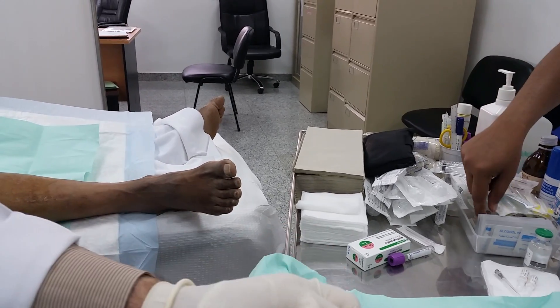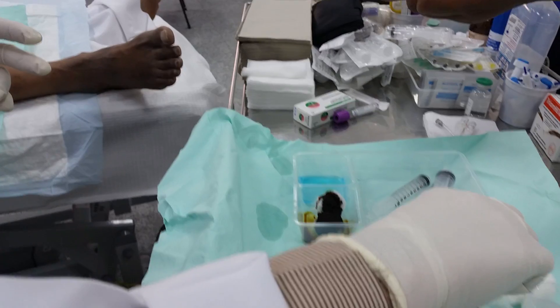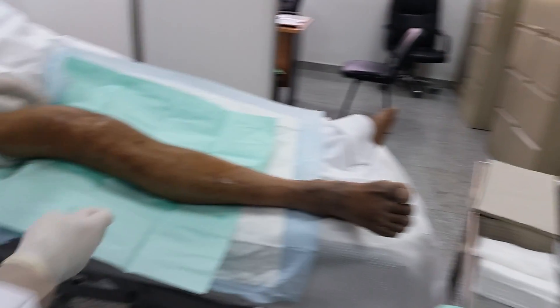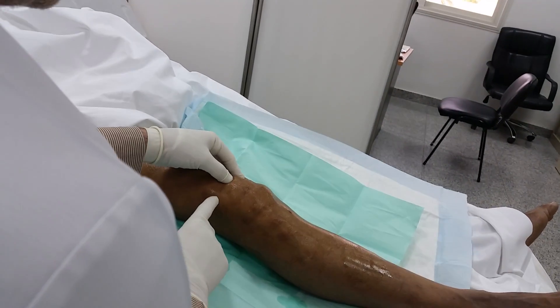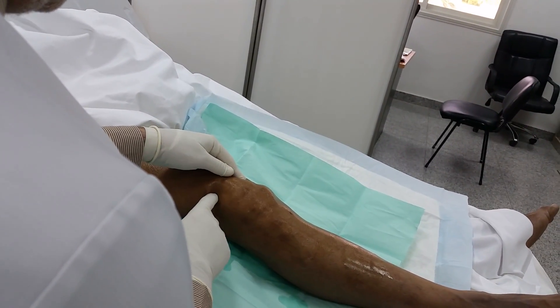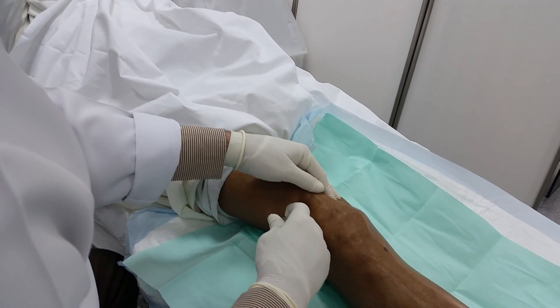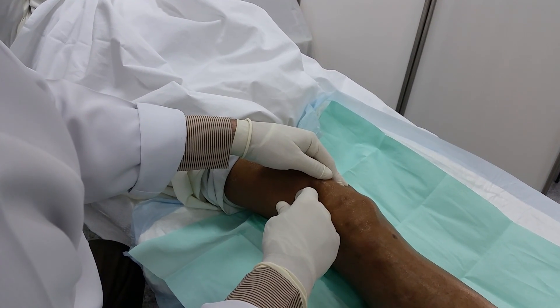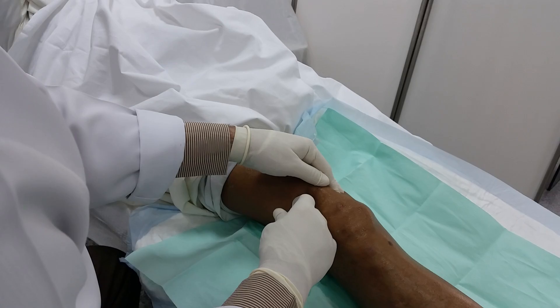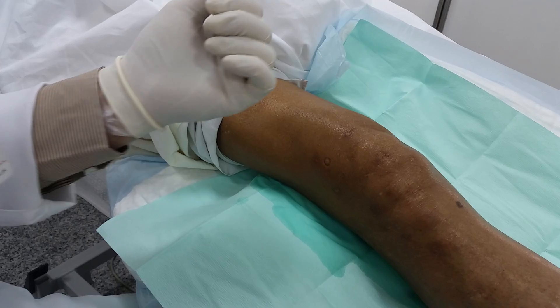I have these sterile bottles arranged for aspiration. Now I will palpate the knee after sterilization. I will identify the upper pole, the suprapatellar bursa, the quadriceps tendon, and posterior to the quadriceps tendon I will make a mark for my needle entrance — I will use the needle hub to make a depression. This depression will be persistent until I finish.